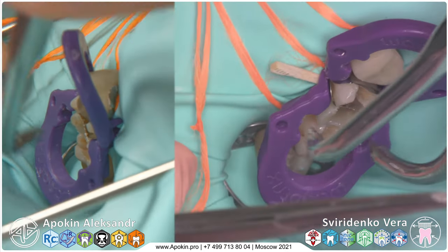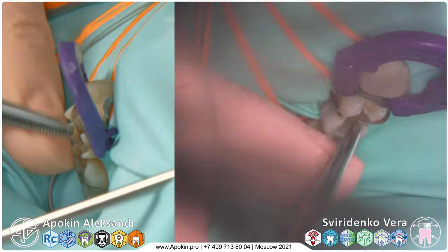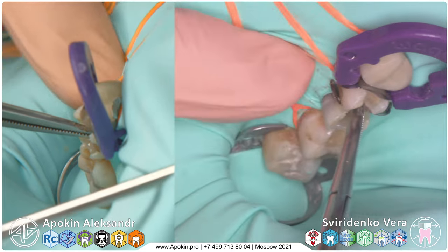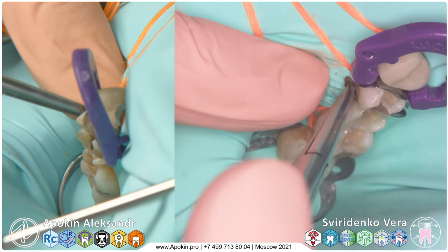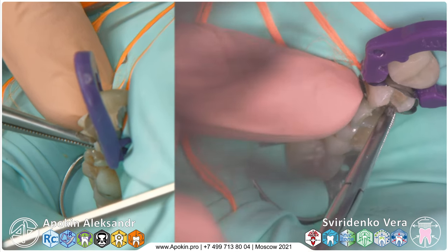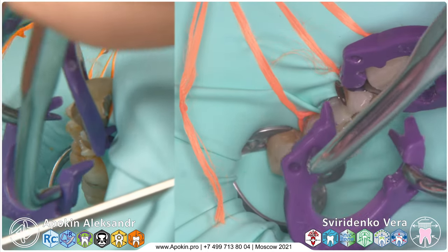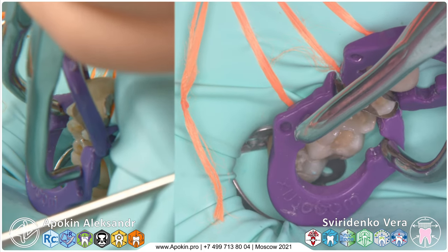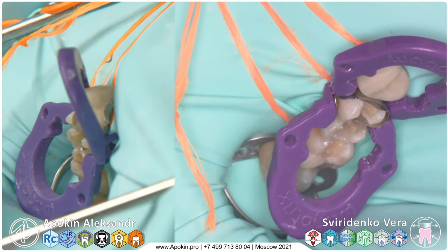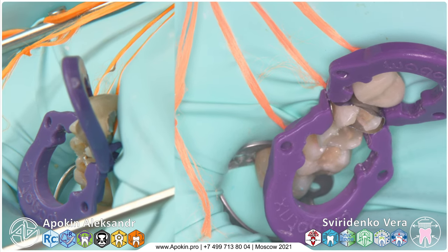If you are unsure, remove the ring, check the matrix again, insert it deeper. Check your rubber dam. And then place the ring again, very carefully. I think this is good. Again, place composite parts.